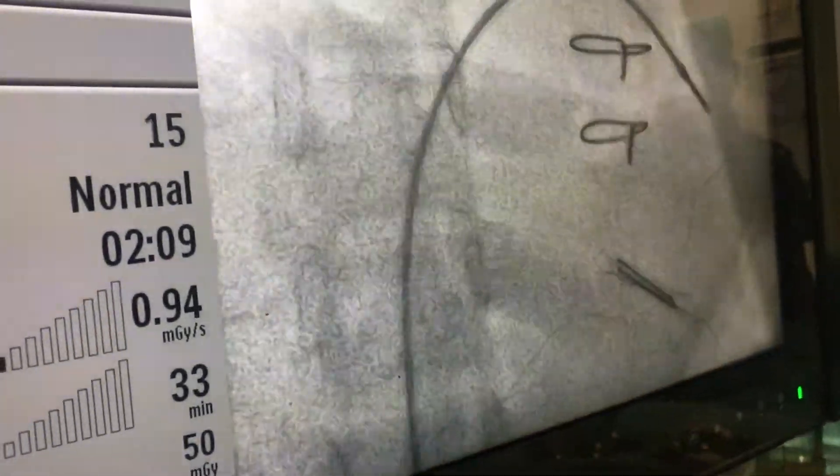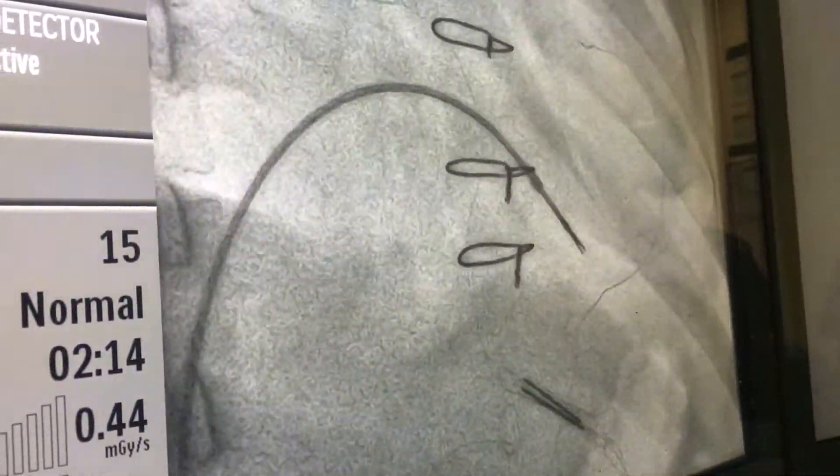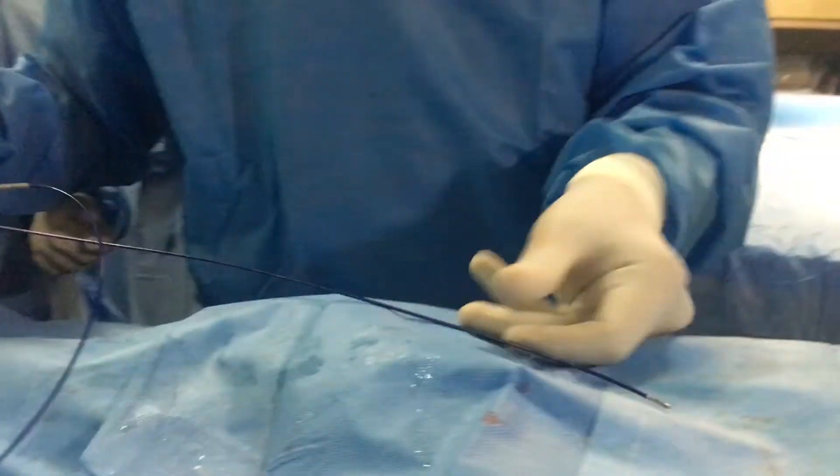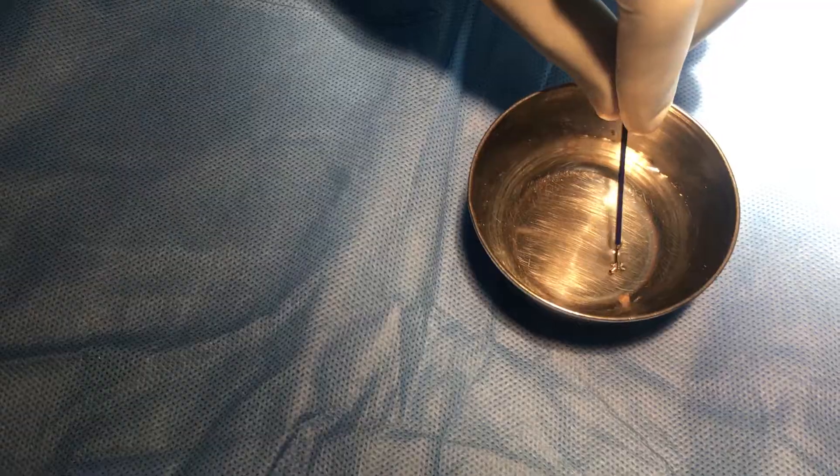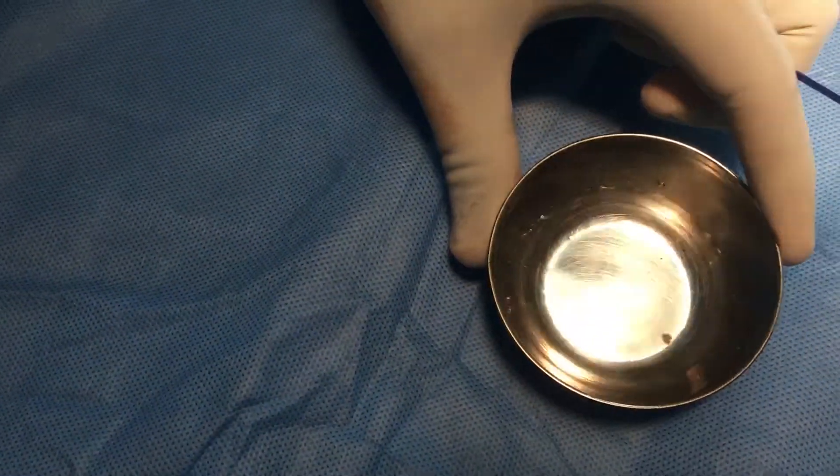So I'm just trying to grab the tissue. See, I have grabbed the tissue. And then I'm just taking it out. Yeah, okay. We'll just see how much tissue we got. Yeah, so you can see here. This is a bioptome forceps sample is here. Yeah, so it's slightly pale. Grossly it is appearing pale. Okay.